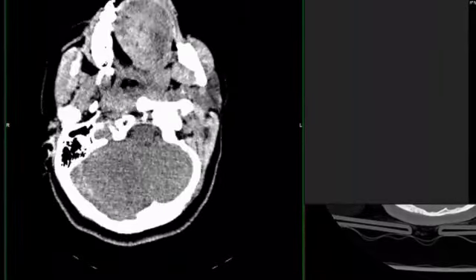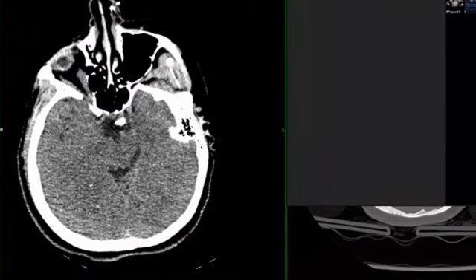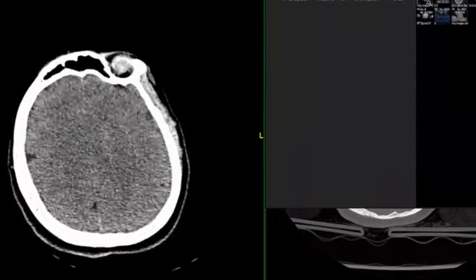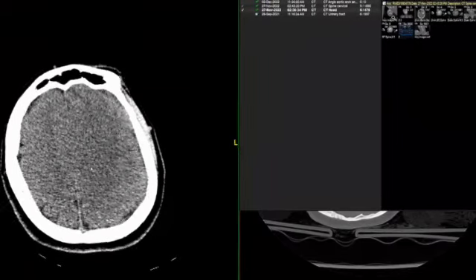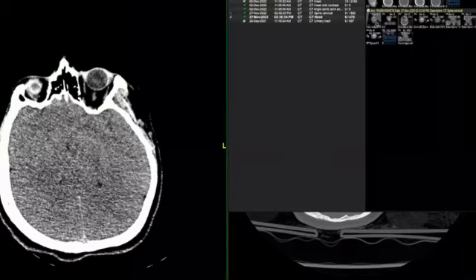This was the CT head on presentation. Again, it can be quite difficult to look at, with funny angles and an ET tube. But as you scroll through, she's 25, and you get the impression that even with that funny scan angle, you just can't see the grey-white matter differentiation as you ought to. Coming up to the top of the brain, there's a bit of sulcation, so maybe that's normal for 25. There is a bit of variability here, but it's very hard to appreciate some of those deep grey structures. But if that scan report is normal, so be it.